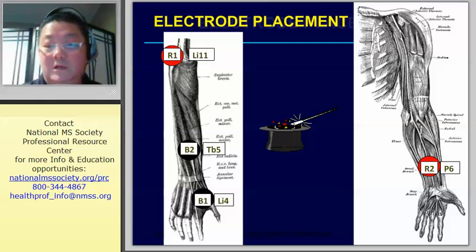So, best of both worlds, you're going to hook both together, both sensory and motor analgesia in the same treatment. All right. Parameters are still going to be 15 minutes on 100 pulses per second and 15 minutes on 2 pulses per second for a full 30-minute treatment. Gives you quick pain relief but long-lasting outcome. The same technique is used in terms of onset. Right, electrode placement, fairly important. So I'm going to spend a little bit more time on this piece of the puzzle.